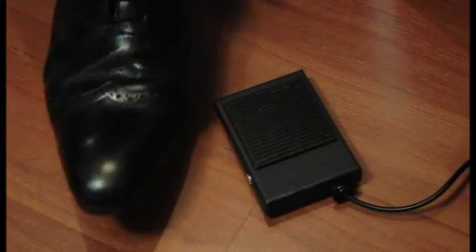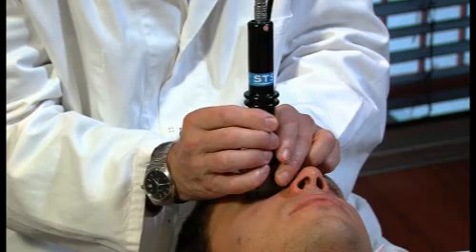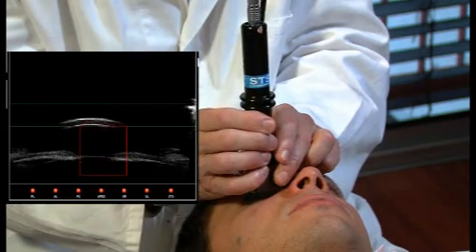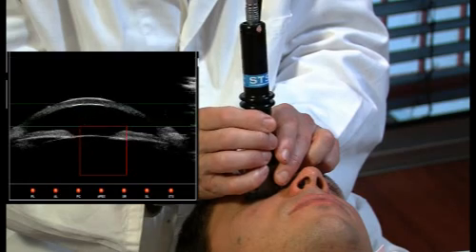As he is already using both hands, the operator uses the foot pedal to start the acquisition process. Ten measurements are automatically displayed.